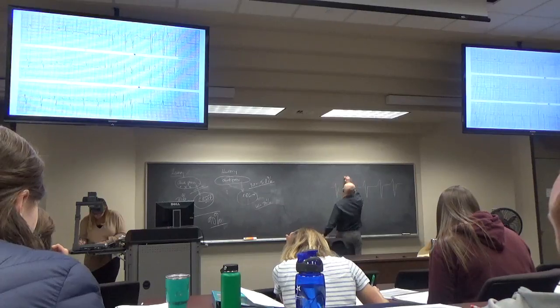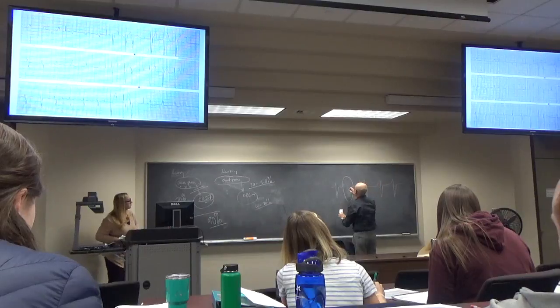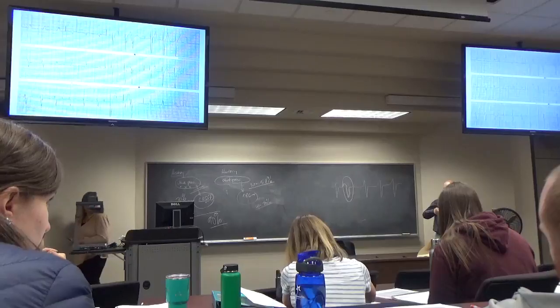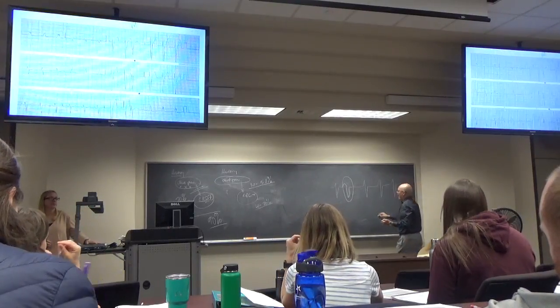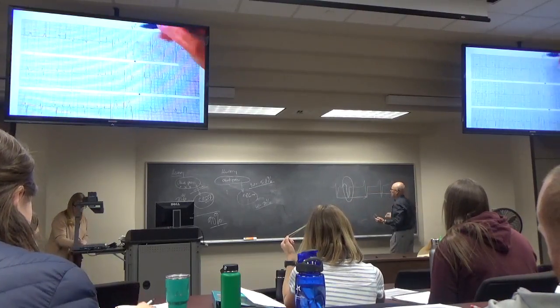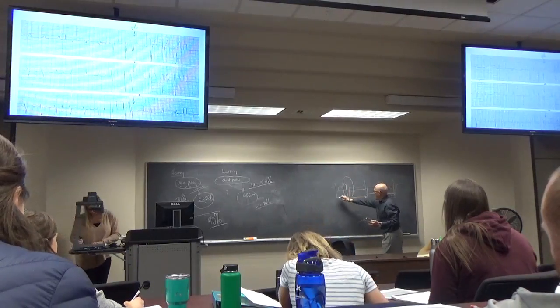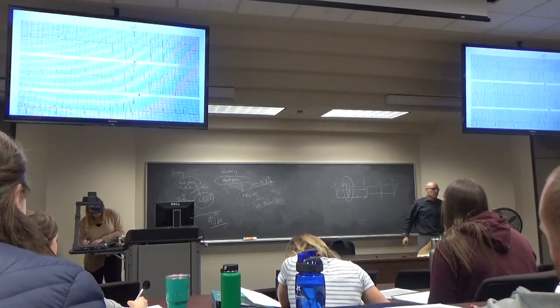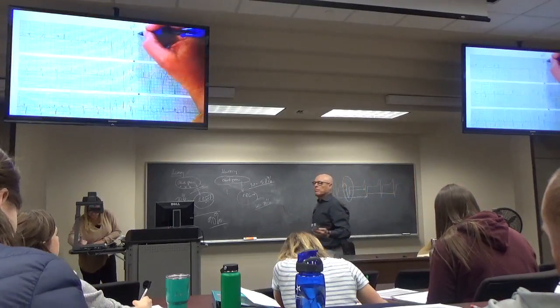Okay, here's your PVC. Now, I probably drew that one a little wrong. Let's draw it like this. It usually looks different, as this one does, than the rest of the QRSs. It comes too early, and there's a compensatory pause. This is too early, this is too long, and the R to R interval is the same as all the other R to R intervals. It's too wide, it's too early, and there's a compensatory pause.